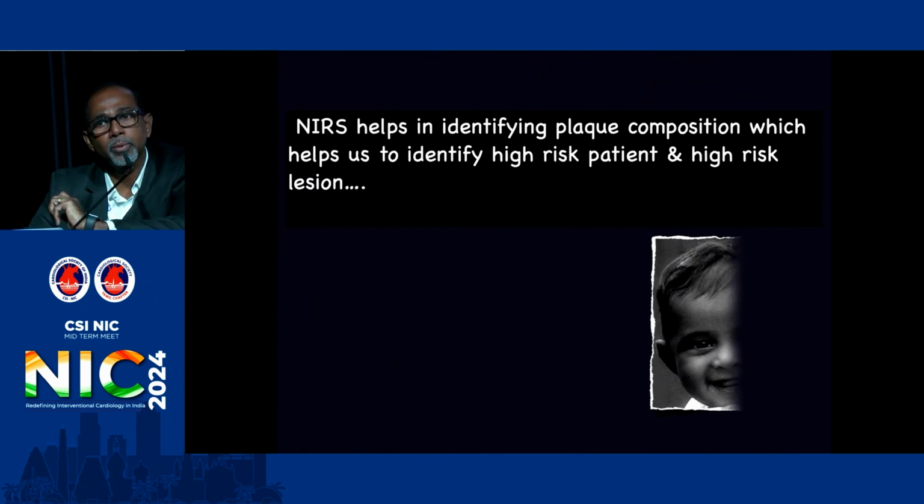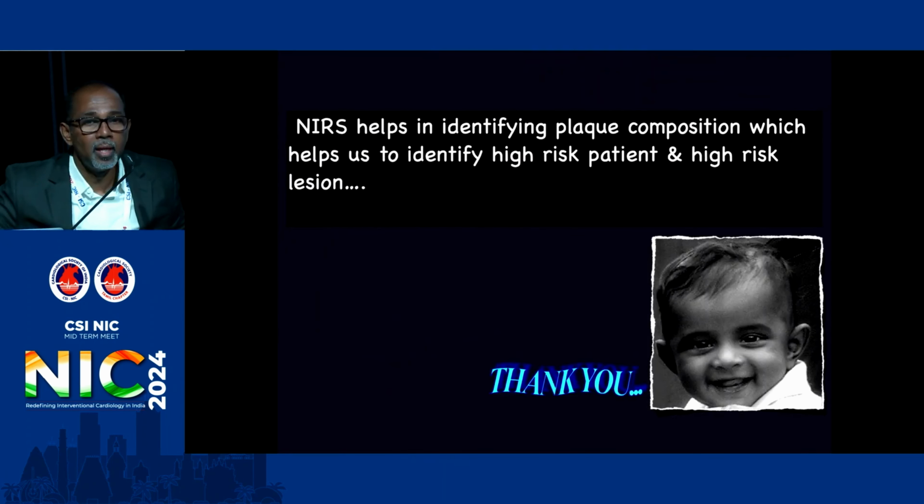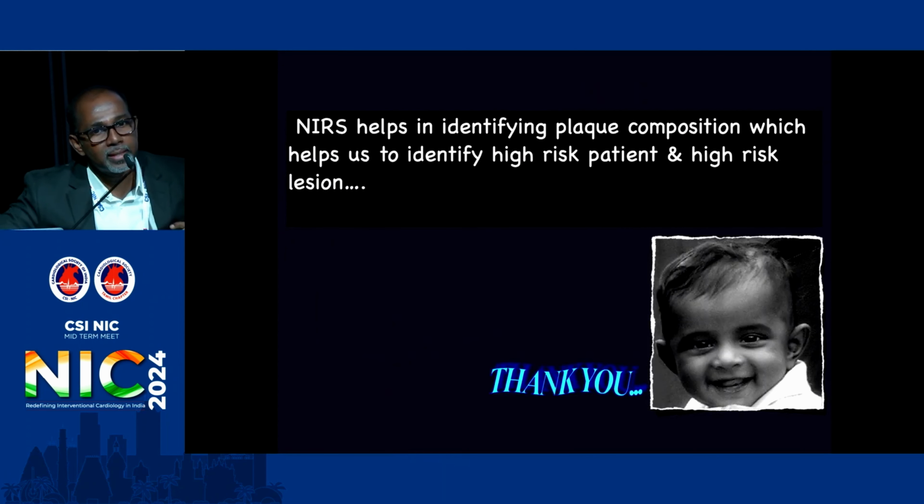So dear friends, what I was trying to tell over the last 10 minutes was just to highlight the usefulness of NIRS in identifying a high-risk patient as well as a high-risk plaque, so that we can modify our decisions during intervention so that we could have a better acute outcome as well as a long-term good outcome.